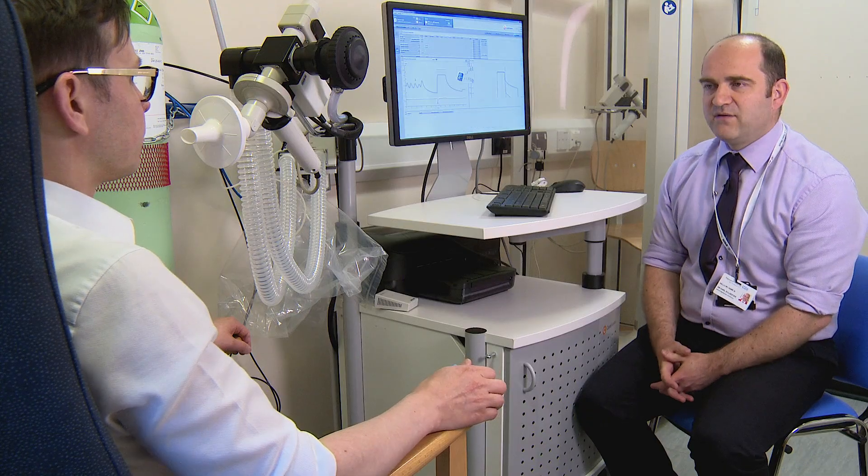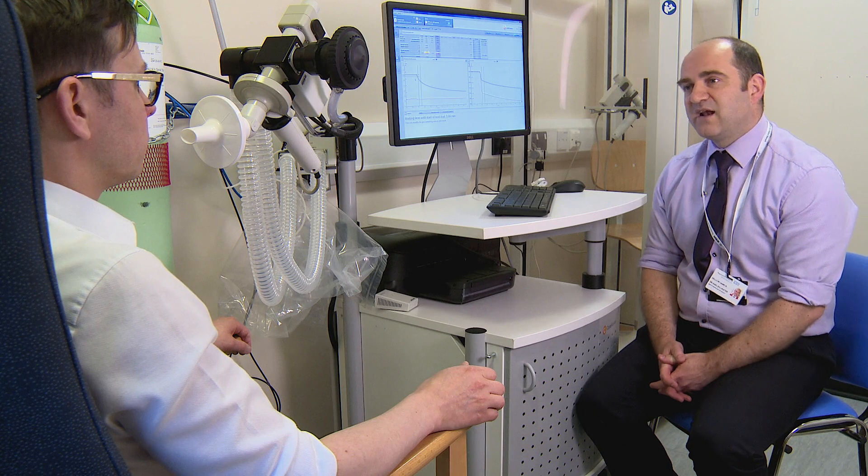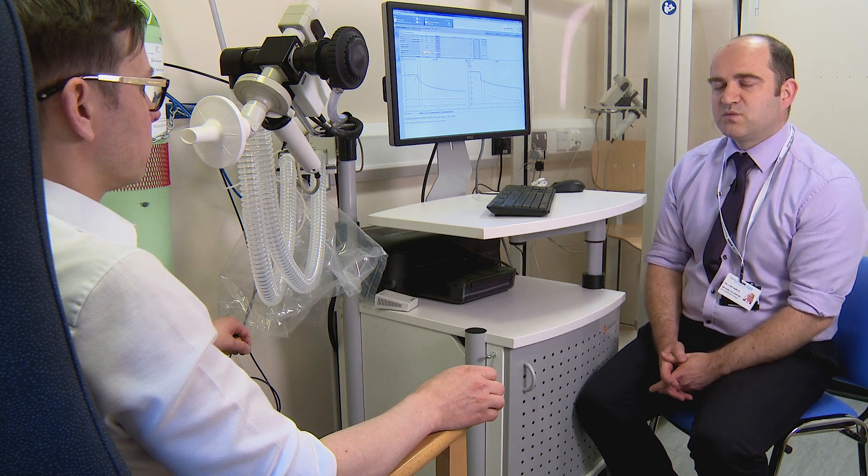So with this test, we need to leave you to relax for about four minutes. After that four minutes, we'll just do exactly the same again and make sure it matches what we got with the first one.